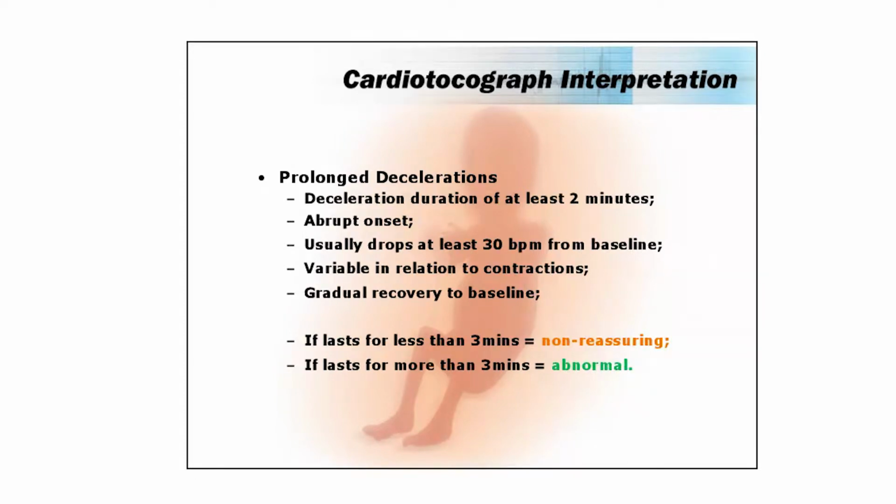In actual fact, in most cases, they'll say I have a bradycardia. In most cases, when midwives in my country say I've got a bradycardia, it's not. It's a prolonged deceleration at that point. It may become a bradycardia, but a prolonged deceleration is a deceleration that lasts at least 2 minutes.